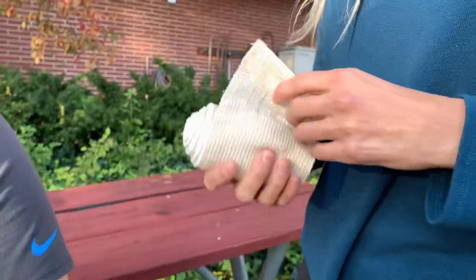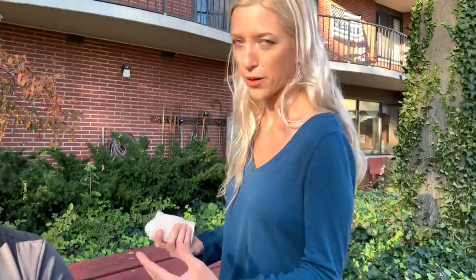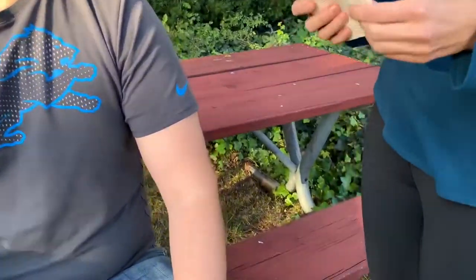So this is a four inch ace wrap. You can go to a larger size — there are six inch ace wraps, and I would actually recommend it for someone his size because his arm is bigger. But we're just going to use this four inch because that's what I have right now.